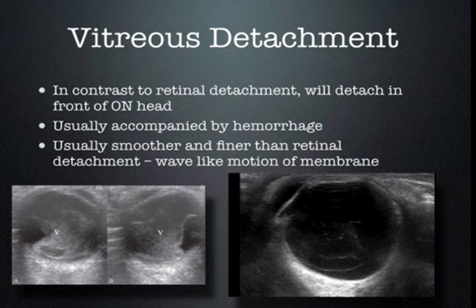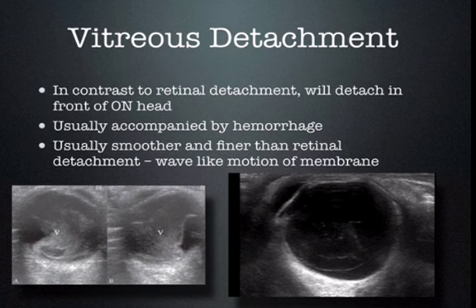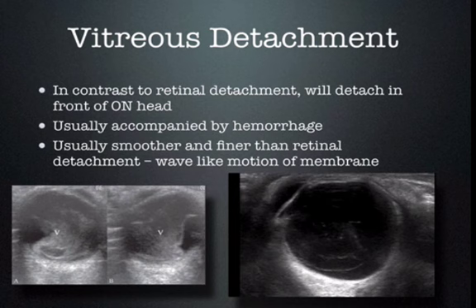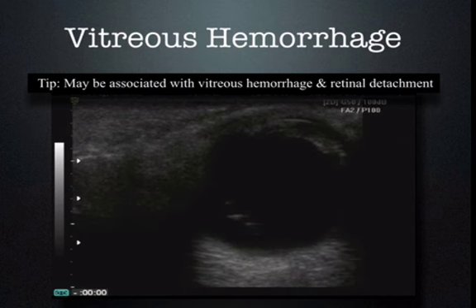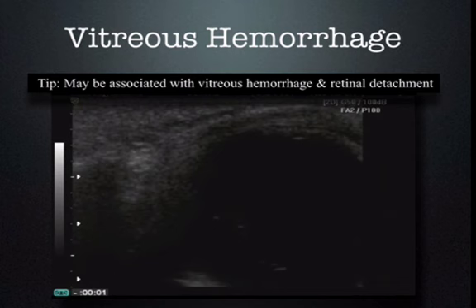A vitreous detachment is really just contraction of the vitreous pulling away from the retina, in distinction to a retina separating from the blood supply of the choroid. You generally have hemorrhage with both retinal and vitreous detachment, so you cannot use hemorrhage alone to distinguish them. Vitreous detachment is not really a membrane — it's generally finer and smoother than a retinal detachment and is not as hyperechoic as the retina. It will still retain wave-like motion similar to a retinal detachment. Here we have a very thin, not-so-hyperechoic line that does not follow an anatomic plane and is going across the optic nerve — there is probably vitreous hemorrhage here.